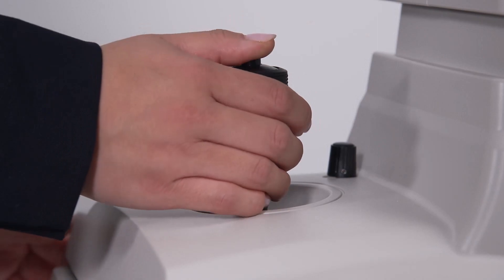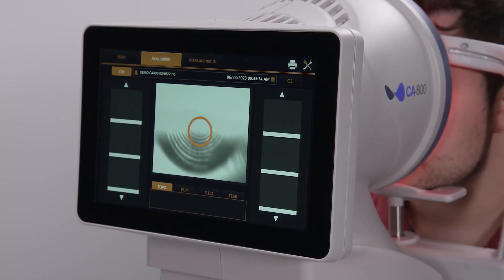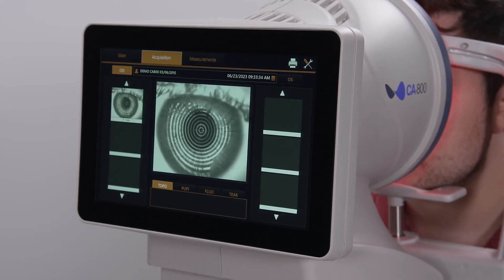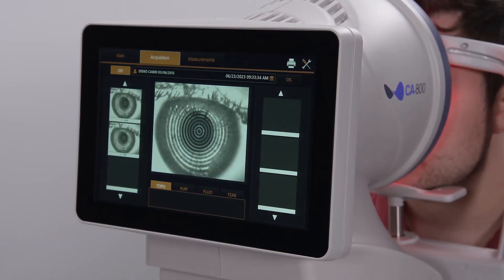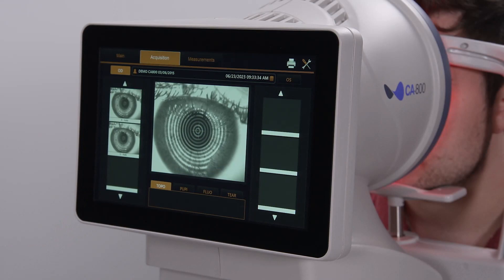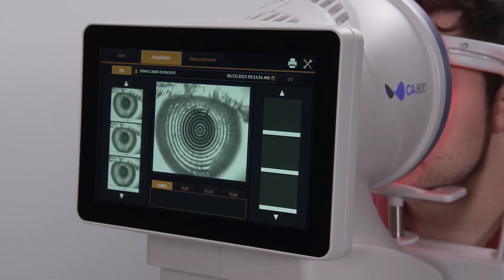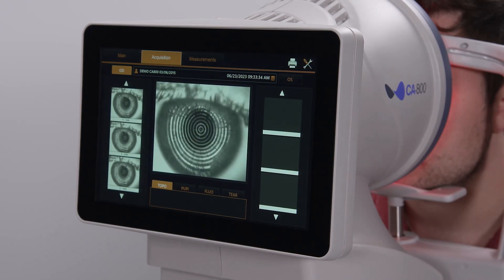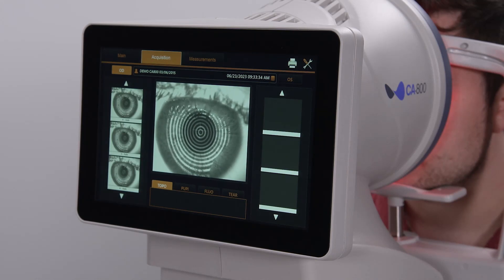Press the joystick button to activate the positioning aids, and instruct the patient to blink a couple of times, then open their eyes wide. Keeping the rings aligned, follow the alignment guides. Blue arrows tell you to move the joystick towards you. Red arrows tell you to move in towards the patient. The green semi-circles indicate the optimum positioning, and when the CA800 is optimally aligned, it will automatically acquire the image.